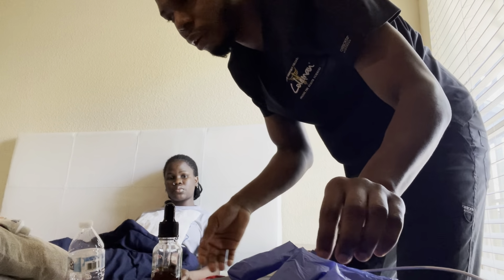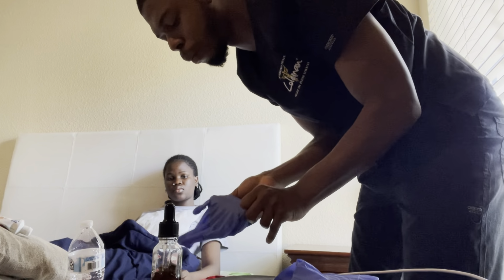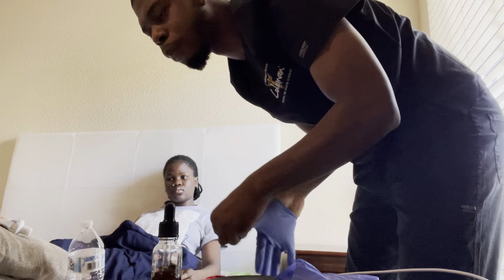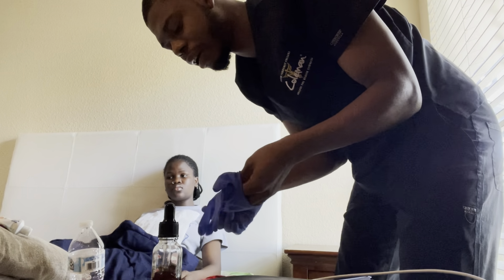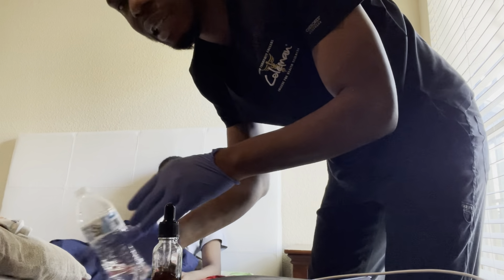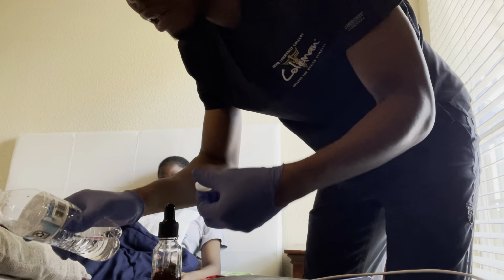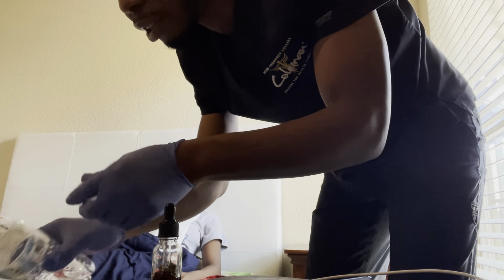After that, I will put on my gloves, my gown, my face shield, in order to prevent splashing. I will pour about 100 milliliter of normal saline into the basin.